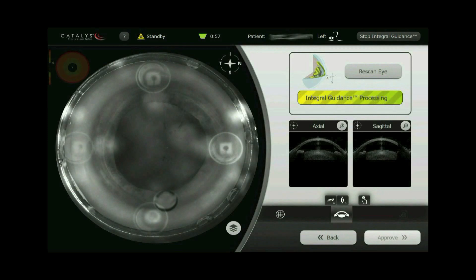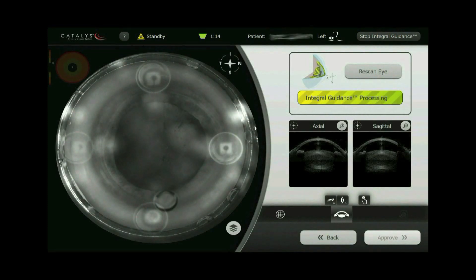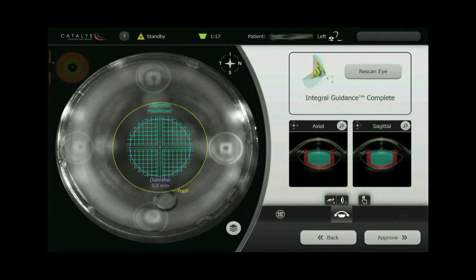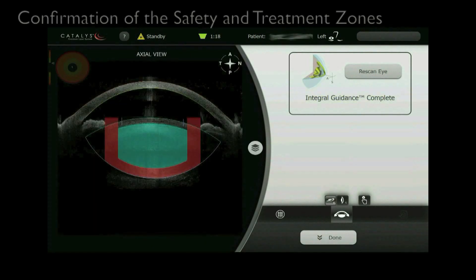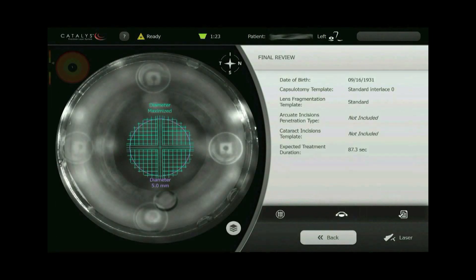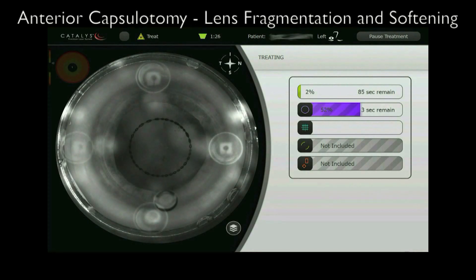For this patient we have planned a 5 millimeter anterior capsulotomy centered on the dilated pupil and 350 micron lens softening. The safety zones in red and treatment pattern in green are confirmed on both an axial and sagittal cross-section. The femtosecond laser then creates the capsulotomy and lens softening.